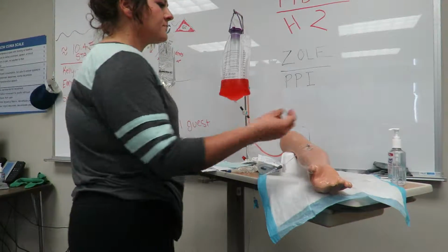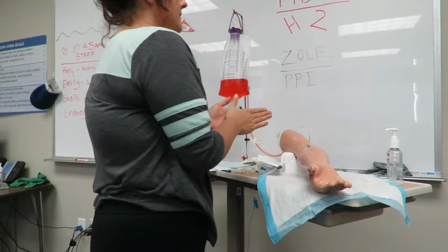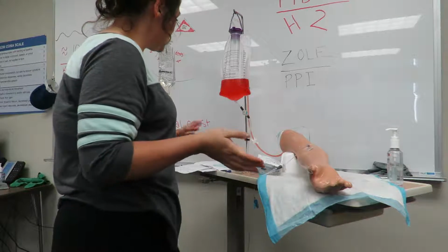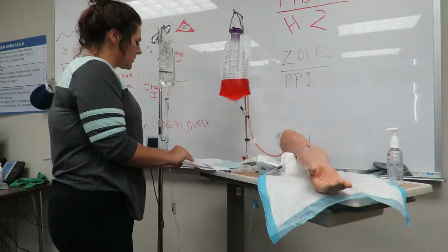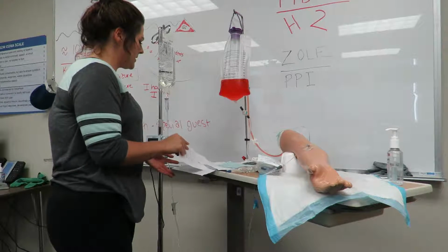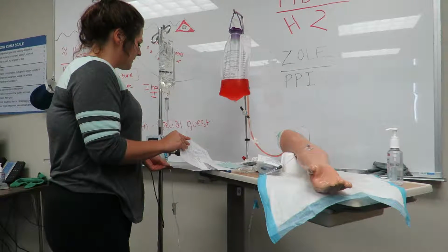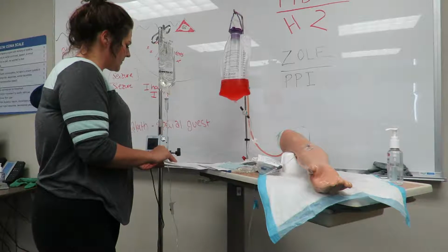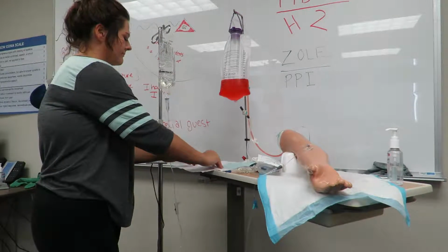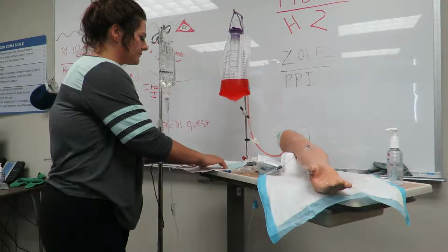All right, perfect. And I'm gonna wash my hands. Again, the curtain is closed. No PPE needed. Checking the doctor's orders, and he has ordered that antibiotic to be administered intravenously. Checking the MAR, that's good. All right, everything here.